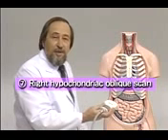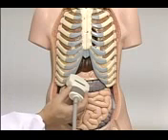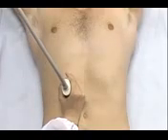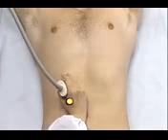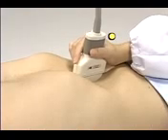Next is the right hypochondriac oblique scan. With this procedure, the right hypochondrium is scanned so as to intersect the right costal margin. Instruct your patient to do abdominal breathing. If clear images cannot be obtained, have the patient lie in the lateral decubitus position.